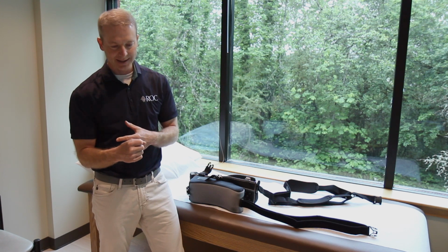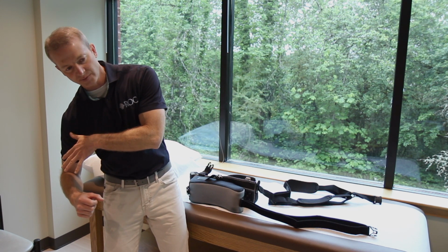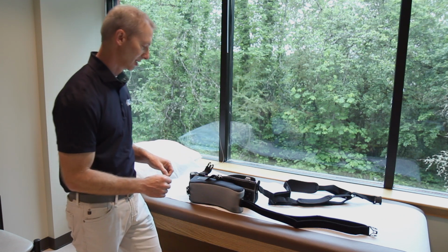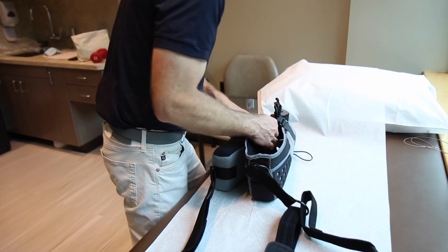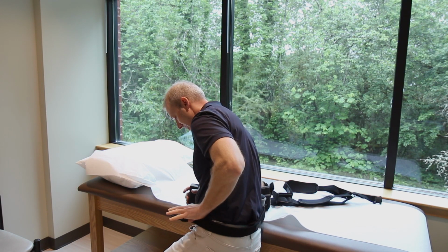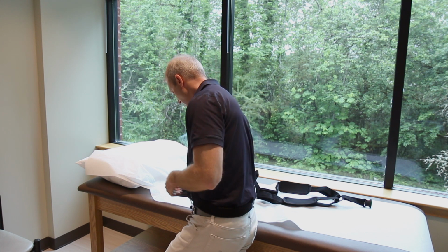So I prefer you not to raise the arm up and try and position the sling to you, but rather to lean over, let gravity hang your arm from your side and get the sling on. And that's what I'll demonstrate. So what I think is the most effective is have it positioned like this. Slide, keeping the arm by your side, slide into the sling like this. Then reach around and grab the waist strap. You can usually use your opposite hand to help with the buckle, like that.